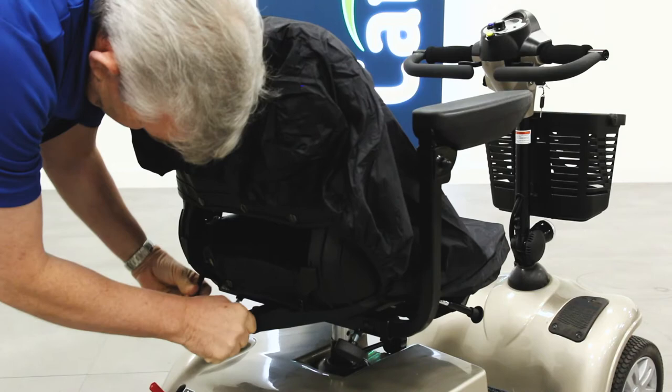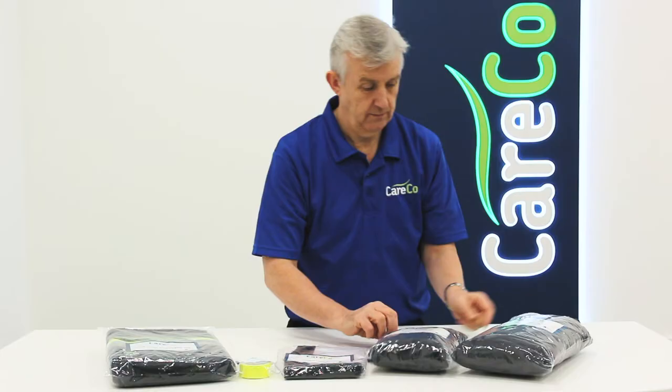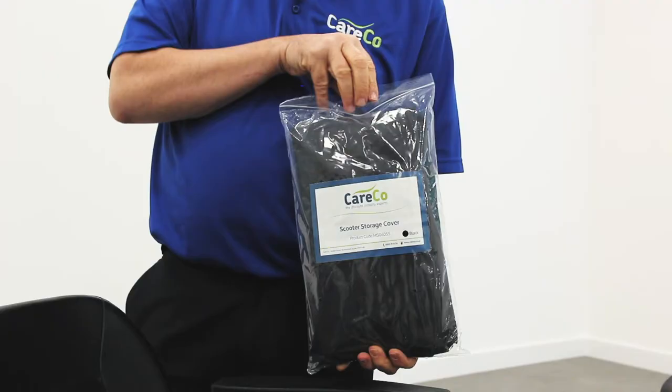The Careco scooter seat cover is another handy waterproof accessory. This waterproof sheet fits tightly around your scooter's chair, keeping it dry for when the rain clears and you head out for a drive.